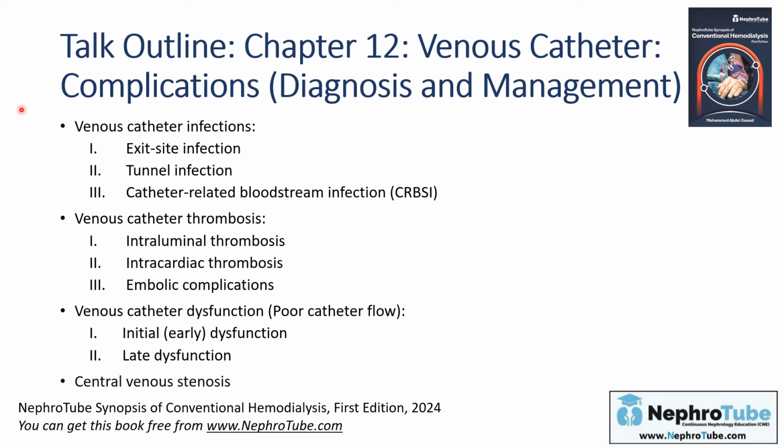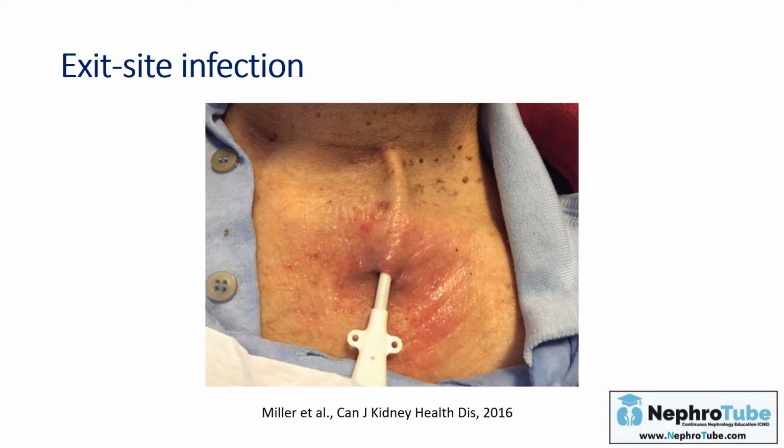This is my talk outline. I will cover venous catheter infections, thrombosis, dysfunction of the venous catheter, and finally central venous stenosis. Starting with venous catheter infections, I will start with exit site infection.